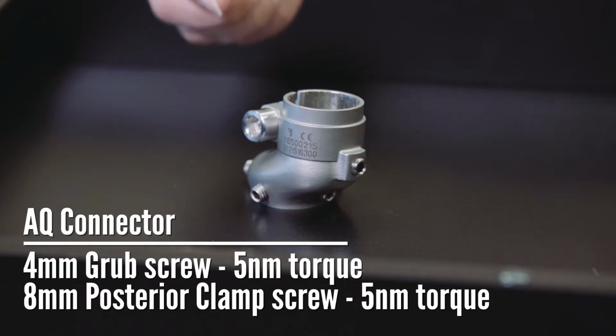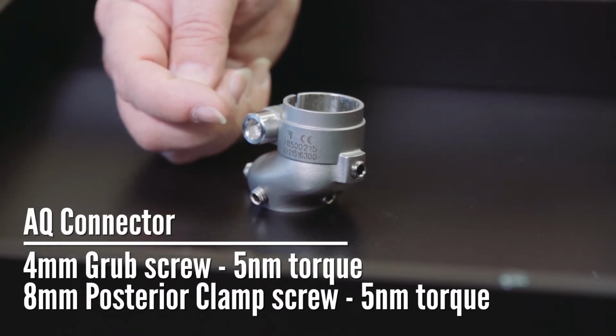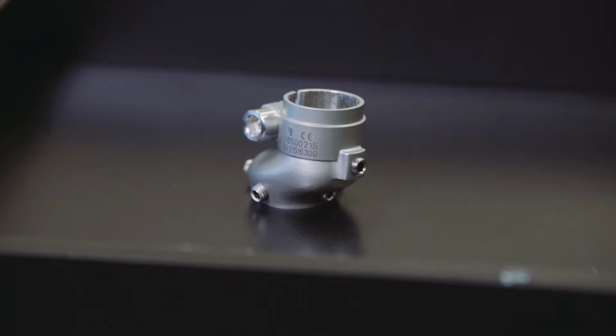The system is also held on by a posterior clamp screw that must also be tightened to 5 Nm. It is important to note that these connectors come with varying offsets and angulations that are built in and are critical to achieve appropriate alignment.